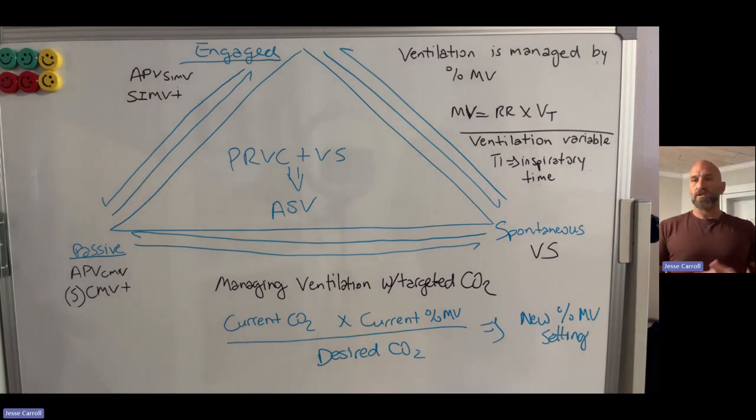All we're saying essentially is no synchronized breathing in this passively breathing patient. No pressure supported breaths either. So essentially a patient that is receiving all of the mechanical breaths from the ventilator and they cannot initiate any sort of spontaneous breathing. Now, moving on.